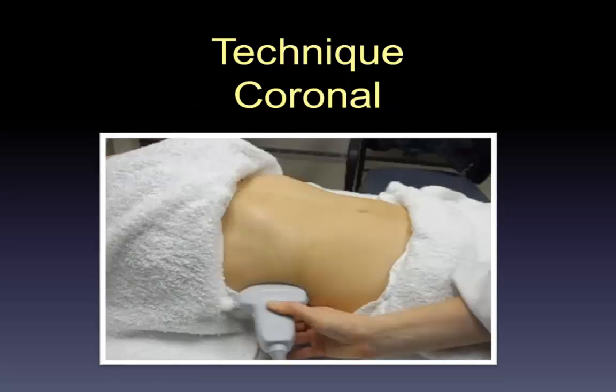Even still, some patients may be difficult, so then you can try coming out laterally to get some coronal views. From here, you're shooting your ultrasound beam through the liver and using it as an acoustic window, and that can be helpful, and you're also getting away from some of the bowel gas. Again, deep breaths may assist you. Make sure you fan anteriorly because the gallbladder sits anterior to the kidney.